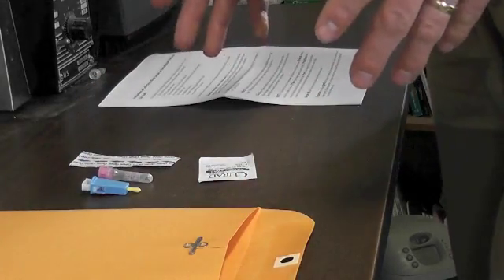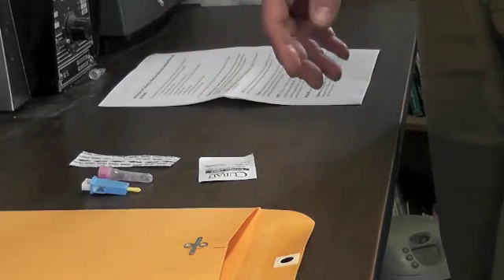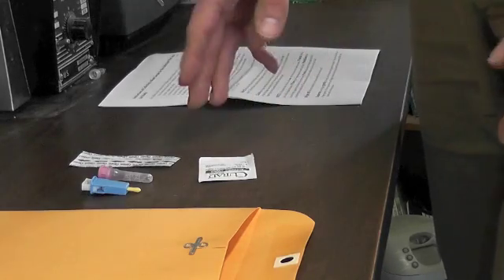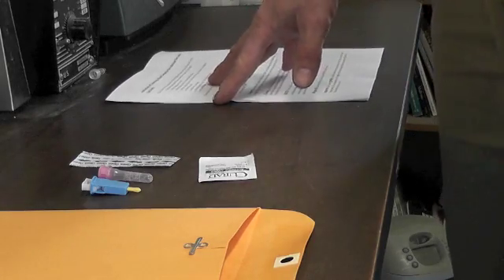In this video I want to concentrate on how to take the blood sample. Everyone can do the paperwork, but not everyone has actually done a blood sample using the finger prick method before. So that's what I'm going to talk about here.